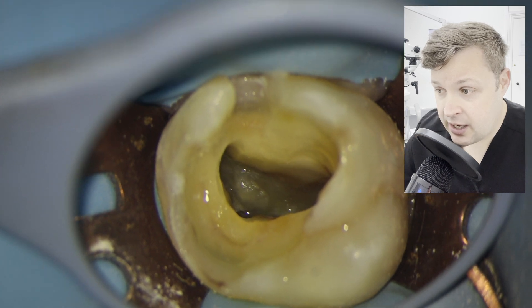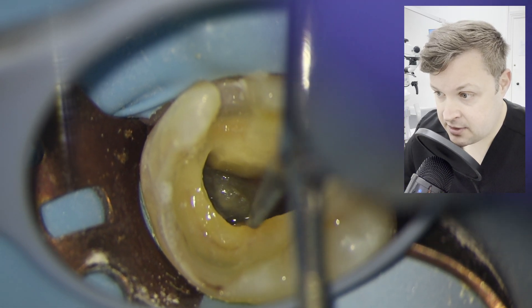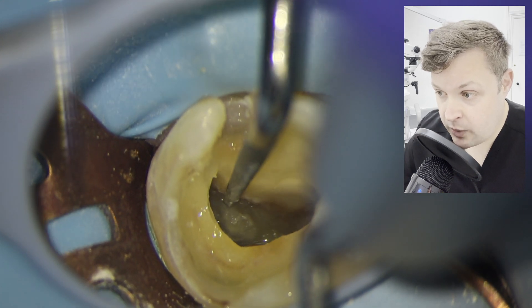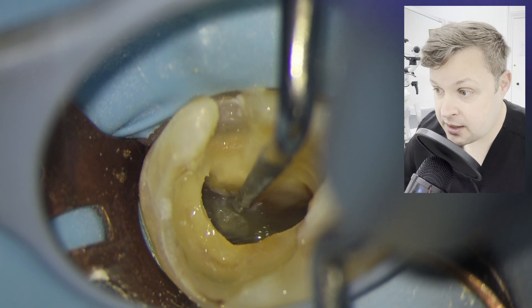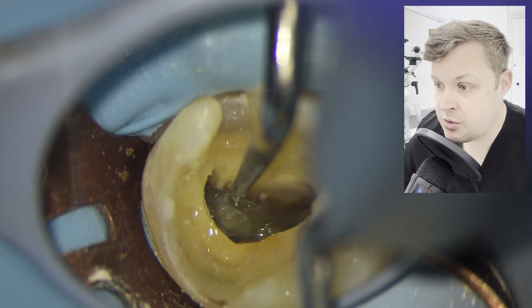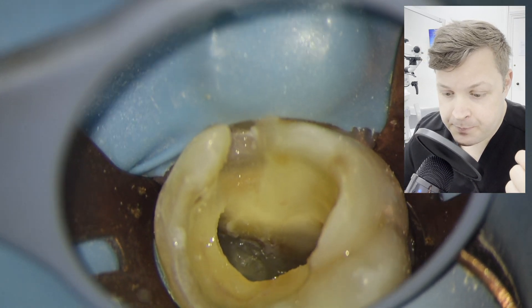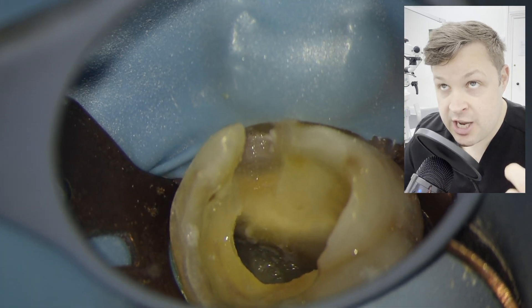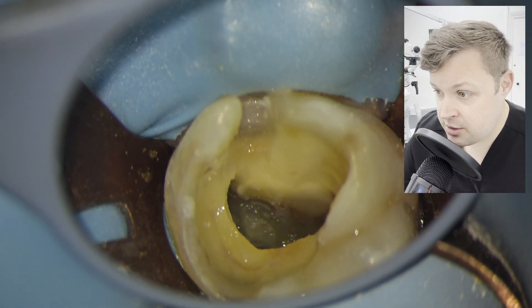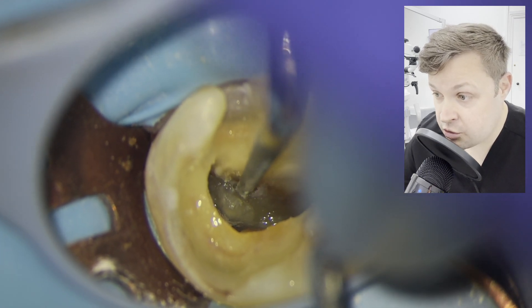I'm going to use some ultrasonic tips — specific endodontic ultrasonic tips with a diamond-coated end that slowly and very gently remove dentin. You could use a fast handpiece down here, but you'd risk perforating the tooth. These are really nice conservative instruments to use. You can't use these on a normal chair ultrasonic — you have to use a specific endodontic unit, because the chair ultrasonic is too strong and will break the tips. I'm just having a very gentle little scout around here, but even with ultrasonic tips you've got to be really careful not to perforate — and I have perforated teeth with these tips before.